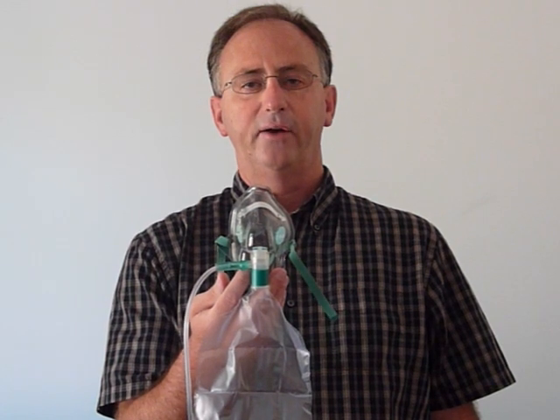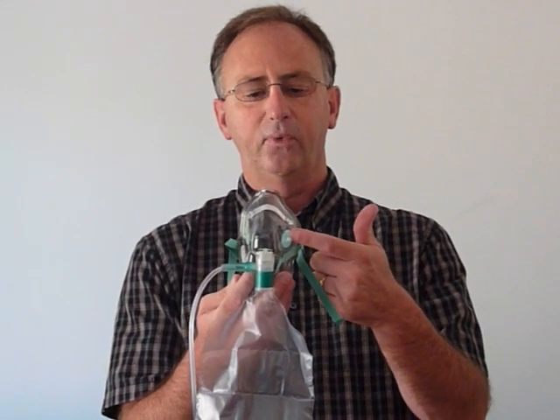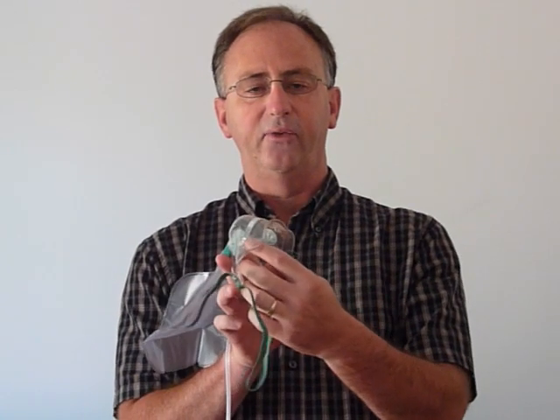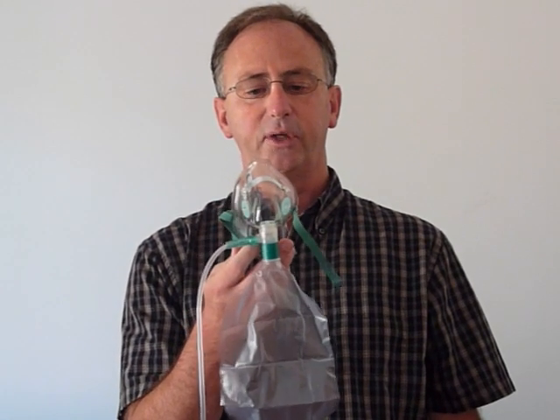This is our adult total non-rebreather mask, bar number 2102. You'll notice that it has a side valve on each side, as well as a valve inside. A total of three valves makes it a closed breathing oxygen mask.